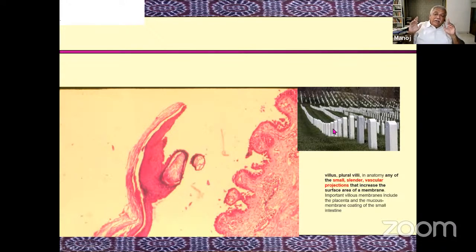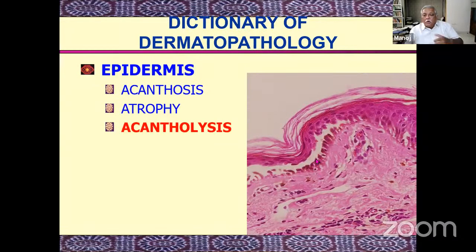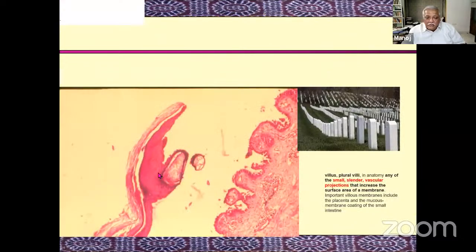And as you know, the epidermis itself is a dynamic structure. The cells of the mid-epidermis pull each other apart into polygonal shape. They pull the basement membrane, and the epidermis retains its structure because of these kinds of tractions. Now, if the attachment between two cells is lost, then obviously the cell will no longer have the same structure of a normal epidermis. So, as you see here, the papilla becomes very prominent because the cells which were giving it shape around it by pulling it have lost their attachment. So you have the papilla here, but it's obviously looking different from a normal papilla. And this has also been given the name of a villus.